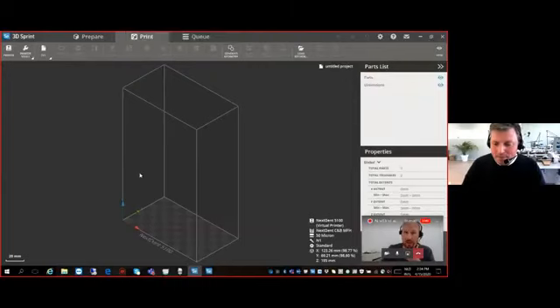Well, thank you very much, Germen. That was really informative. Amazing to see all these new features also coming into the design software. A few questions actually came in during your presentation that I want to quickly go over with you. Yeah, perfect. Let me see to bring you back to life. There you are. The first question, rather at the beginning of your presentation, was from Andrew.